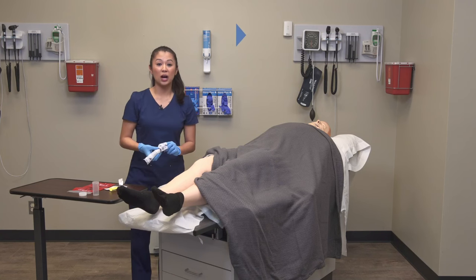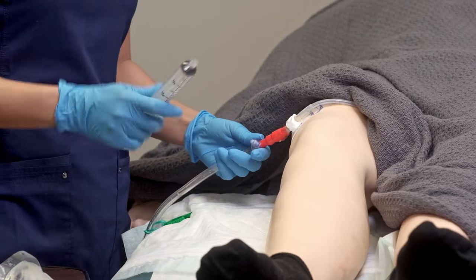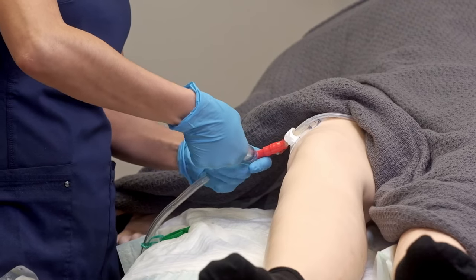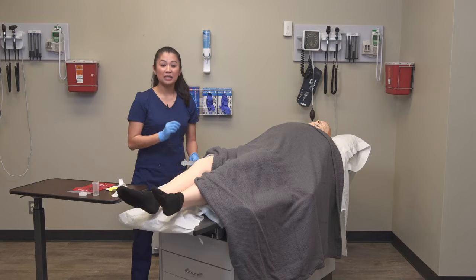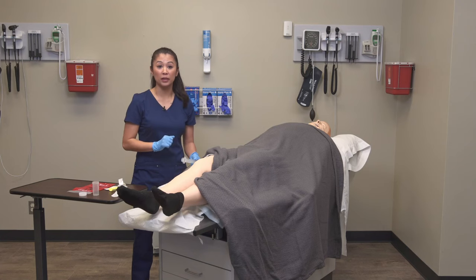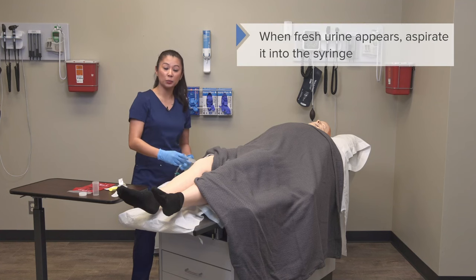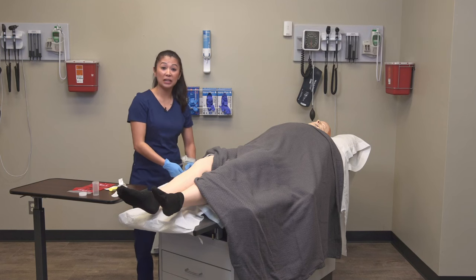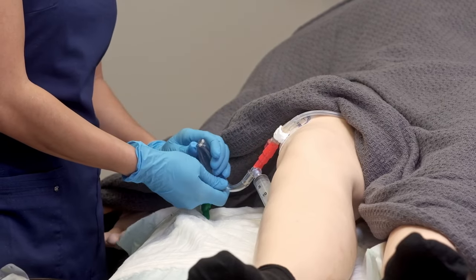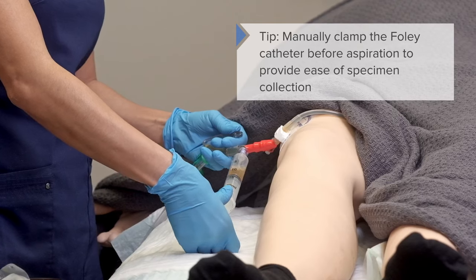Once I've cleaned this and allowed it to fully dry, I'm going to connect my syringe to the sampling port. As you can see, that was a sterile syringe that I'm attaching. I'm going to push it nicely in here — this is called a needle-less sampling port. Sometimes you may have to use a needle to access this, so just know this may vary depending on your equipment. I've connected my syringe and once fresh urine appears, I'm going to aspirate and pull back on the plunger. If it's attached to the bed sheet, go ahead and take this off. I want to make sure I clamp thoroughly here, then I'm going to aspirate urine for my specimen.